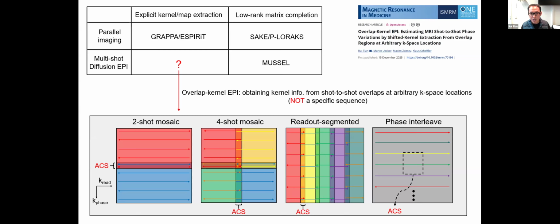The difference is that our kernels are estimated from an averaging of thousands of linear equations. While if you apply an image space total variation operation, like we show in the paper, if you have some errors in the image space, it's a little bit difficult to get rid of them because there's not that much averaging as we can do in K-space.